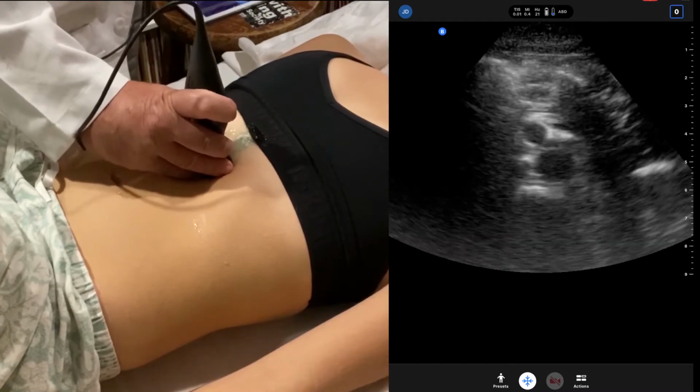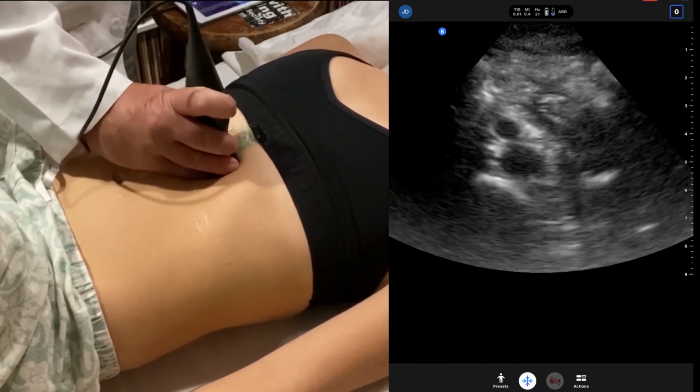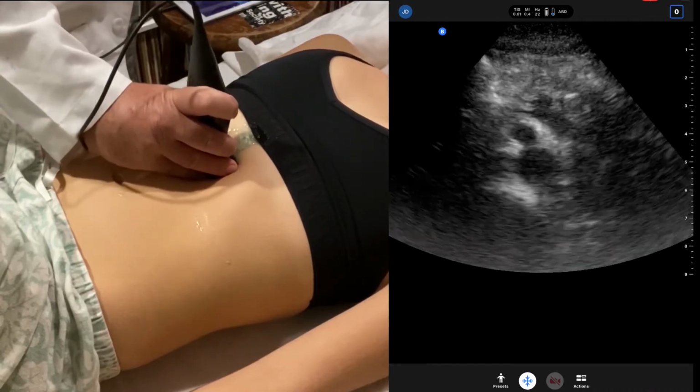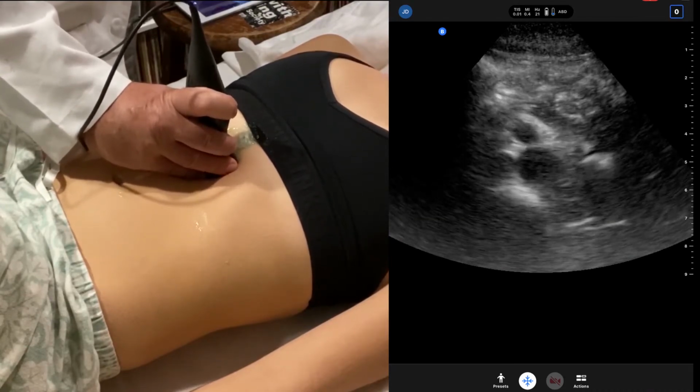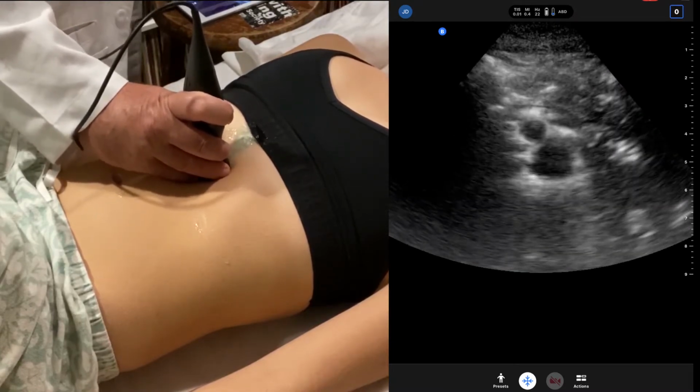And then as we will move on past, we'll go down. I see a hint of it, but can't seem to move the bowel. Right there, the bowel gas out of the way. We see a little bit of the trunk there. And we'll go down to the second stop.